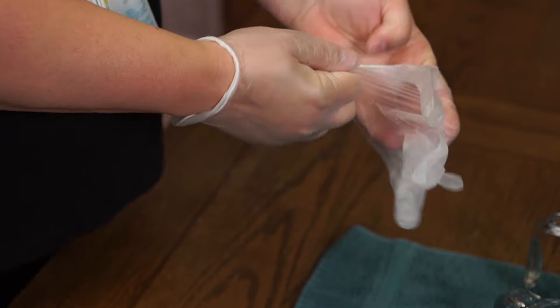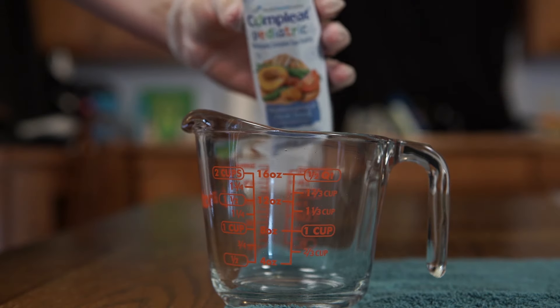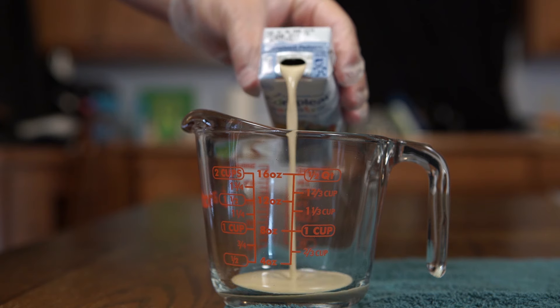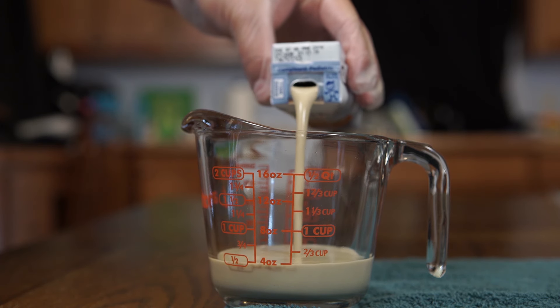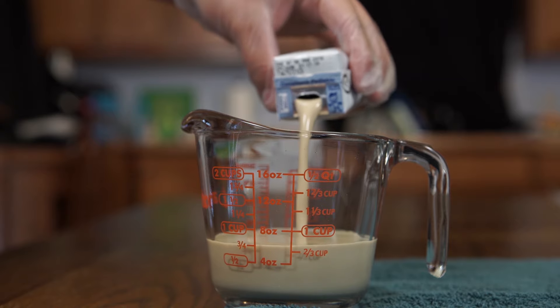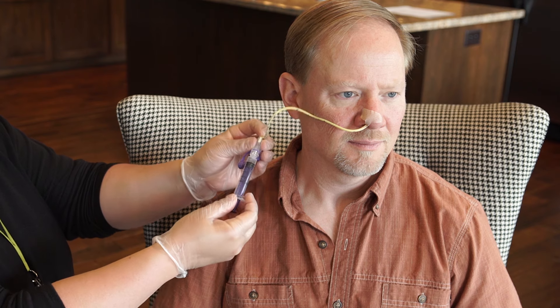Put on the non-sterile gloves. Measure the amount of formula you need for one feeding into a clean measuring container. If you're using a nasal or oral feeding tube, check the tube's placement.